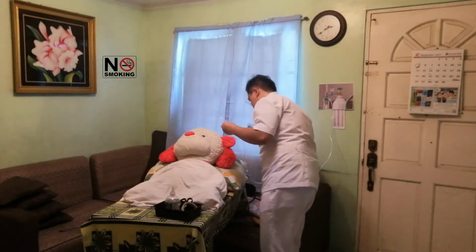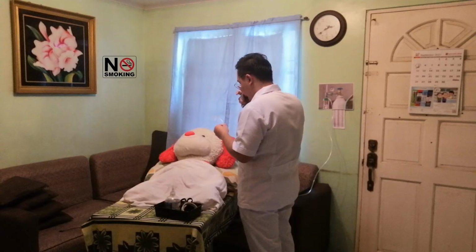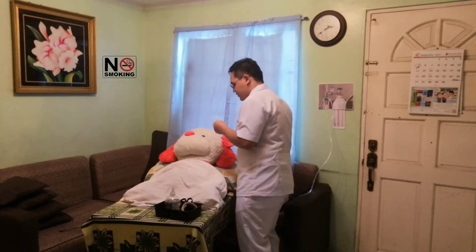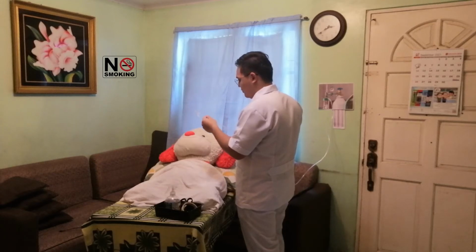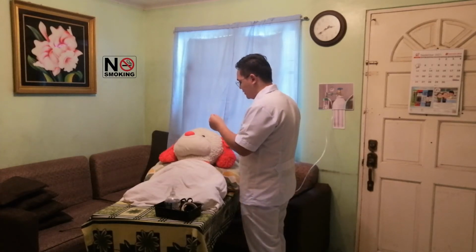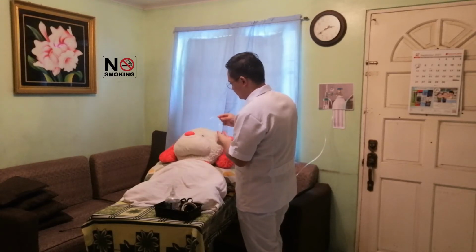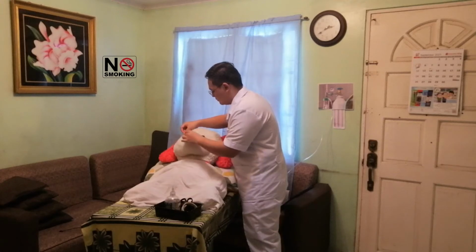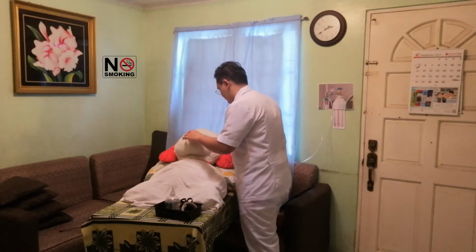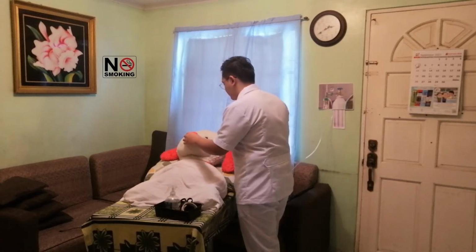Okay. So ma'am, can you stay still po? And we are about to insert po yung atin pong oxygen tube. So you may feel a little bit of discomfort lang po. Okay po. Okay, so behind the client's ears. Okay.